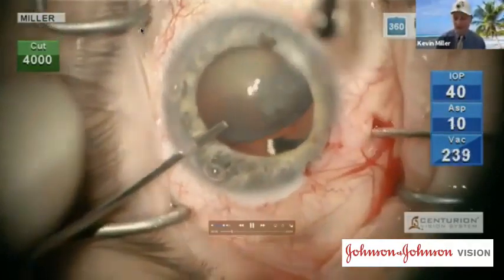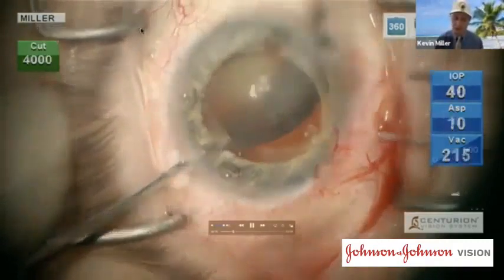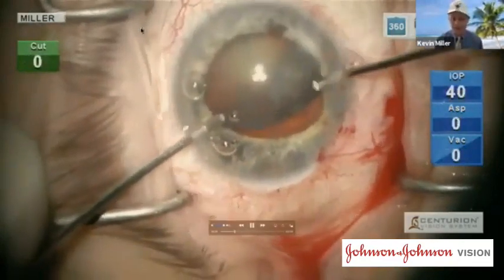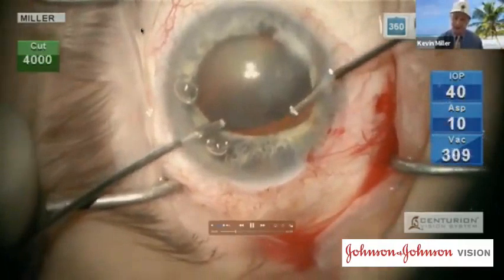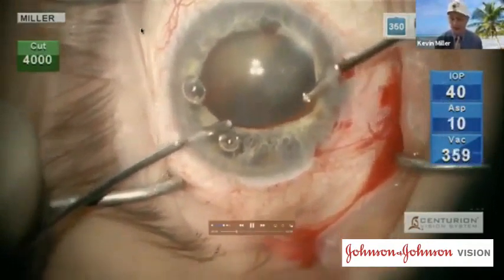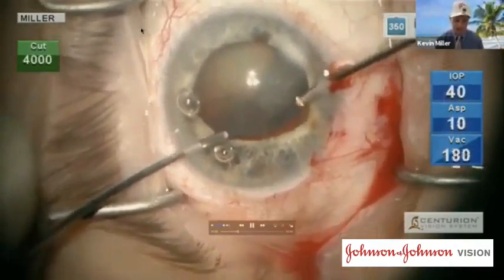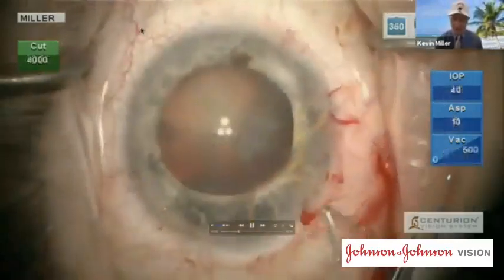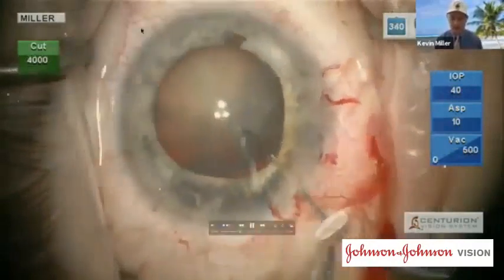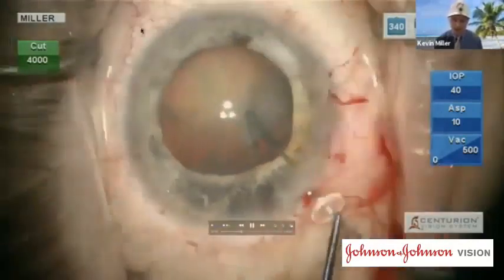Obviously, this eye is vitrectomized down, so you're not going to see the whole thing. But it's important to go after the posterior vitreous first. Try to preserve as many zonules as you can. There's obviously significant loss. After the posterior vitreous is gone, now we're going to take out the vitreous in the anterior chamber, being very careful not to let the iris jump into the vitrector, because irises like to do that. Now at this point, we've done the capsulorhexis, so now we need to secure the lens so that we can then phaco it. So we're using an MST retractor. This is a capsule retractor.